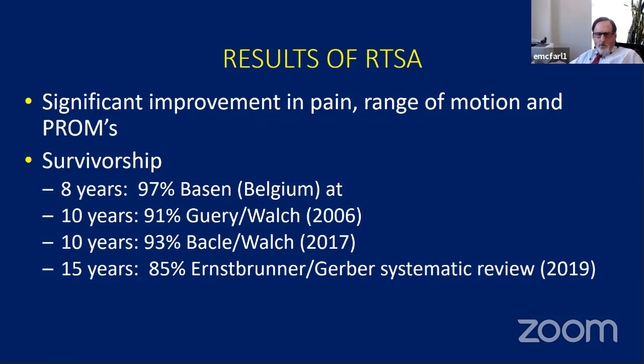As far as survivorship, these are the studies that have been out in the past few years. Early on, the 10-year survival was around 91% with Walsh and others, and that has been maintained. There's only one study with 15-year follow-up, and that was Gerber last year, and they had an 85% survival at 15 years. My personal feeling is it's probably going to be higher than this when we finally start getting some longer term studies. So they're fairly durable, and part of it probably is because many of the patients are older and lower demand.